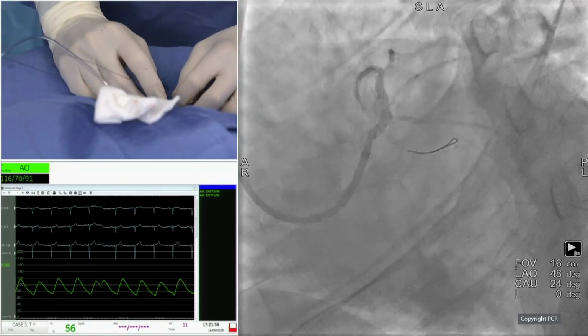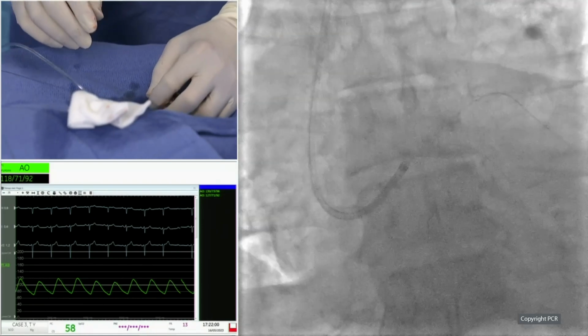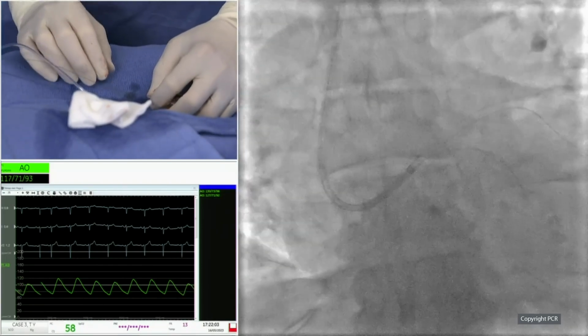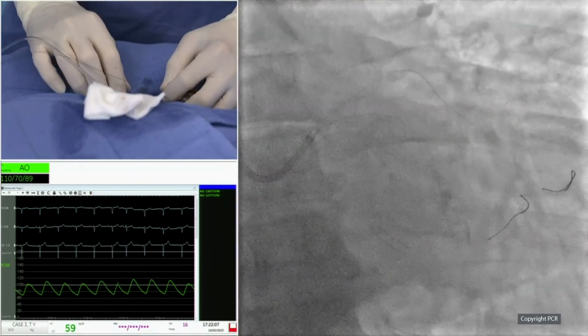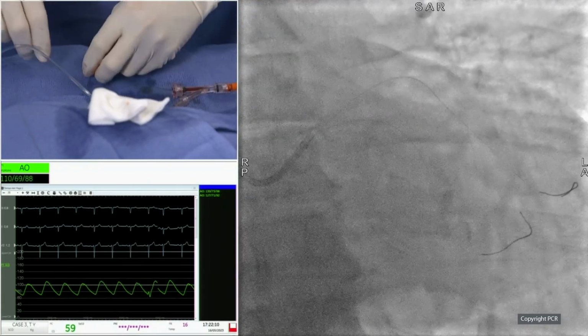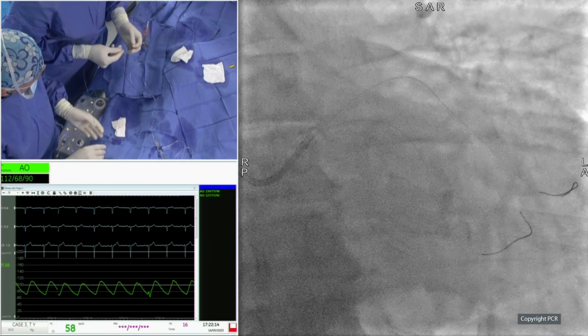That's a good point of consideration, the fact that there are already 23 millimeters of mercury gradient on the aortic valve. Despite the fact that he is 81, these days there are individuals in the 90s who also get a valve.